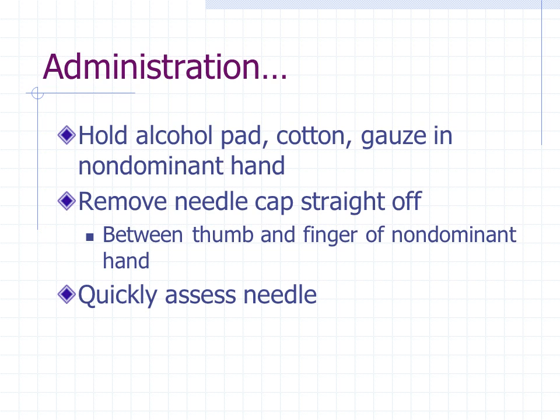Remove the needle cap with your thumb and the finger of your non-dominant hand. Quickly assess the needle. Make sure that there has been no damage to the needle. Sometimes they get bent. Sometimes there's just issues with the needle.